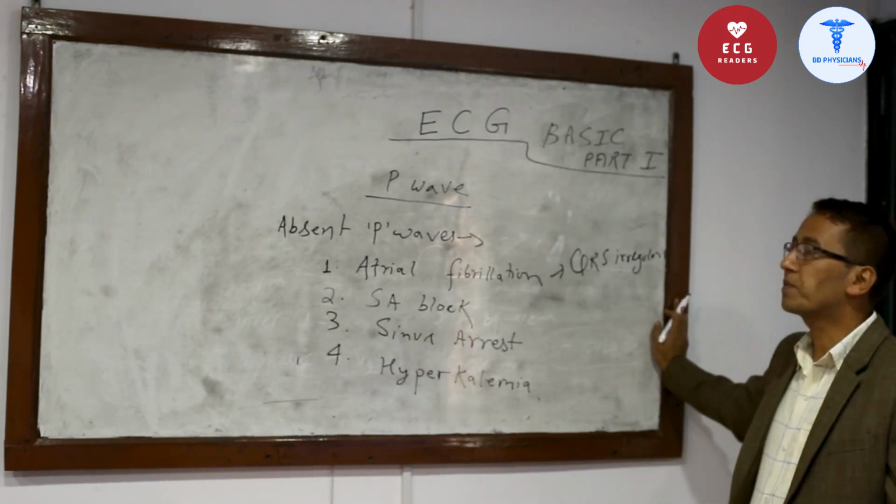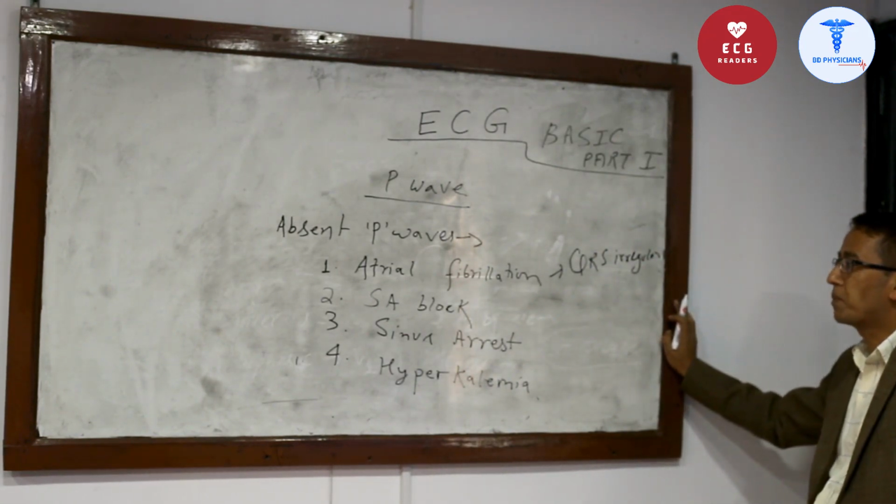How does the ECG look in SA block and sinus arrest?